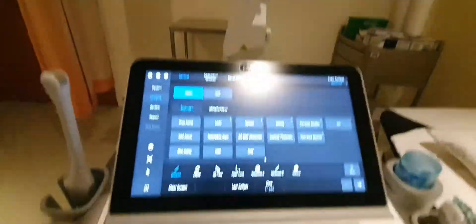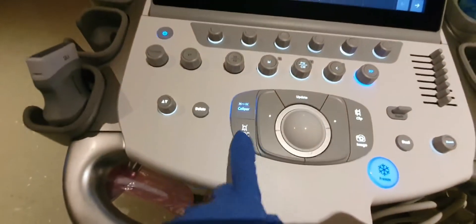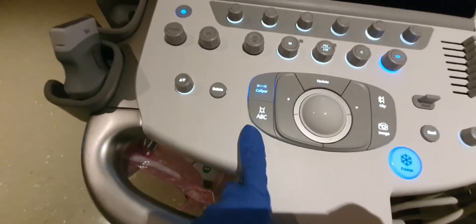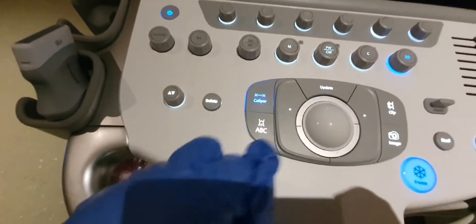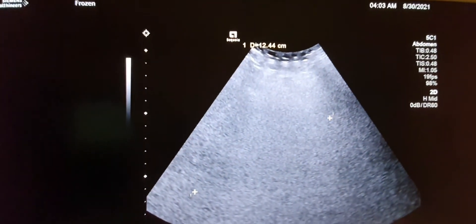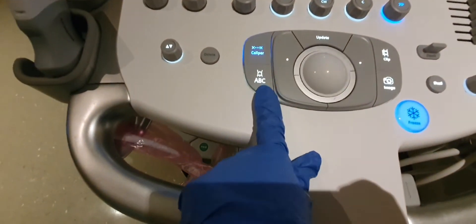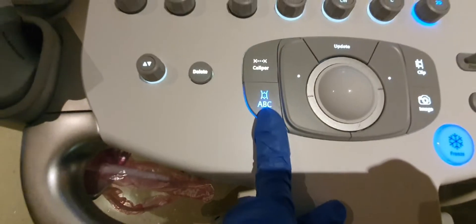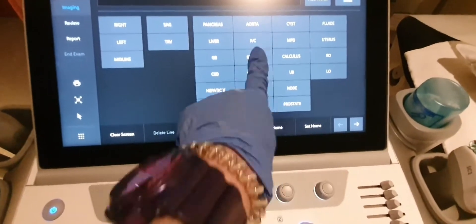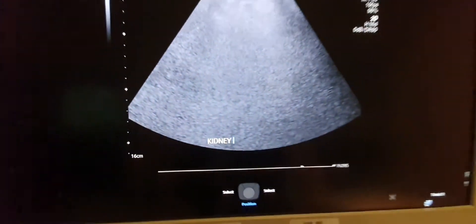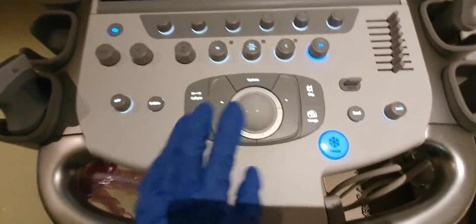If you don't want a measurement, you can delete it. To delete a caliper, make sure it is highlighted, then select caliper and press delete — it's now deleted. You can also change the annotation: select it, delete the old one, and choose a new annotation from the list — for example, kidney.